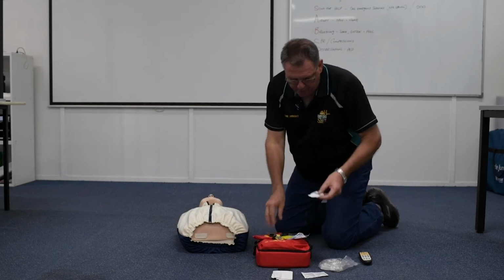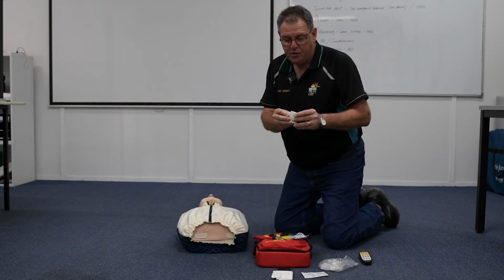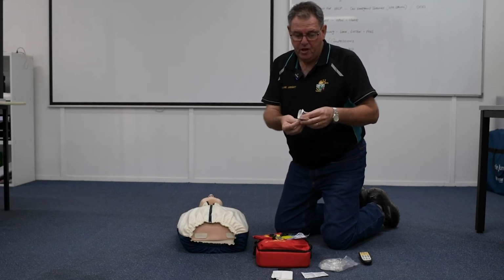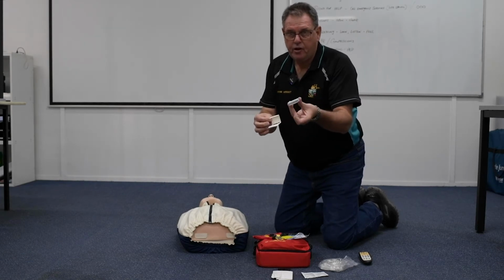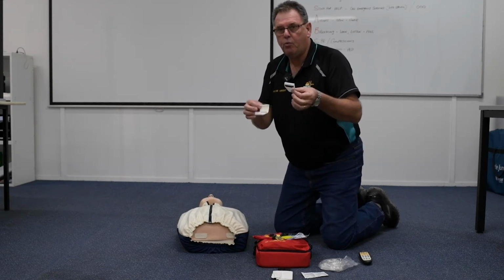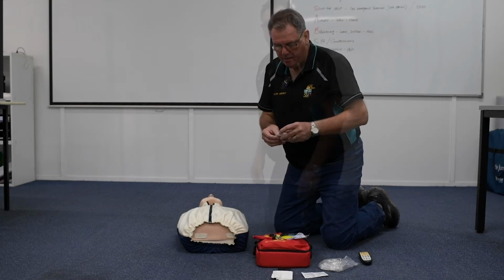We also have a razor. Now, it's very important that you check your kit before you need to use it. You look at this and that doesn't even look like a razor. So it's important to know what equipment that you have got in your AED.